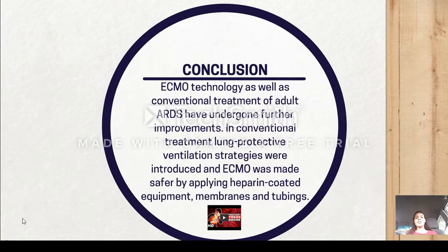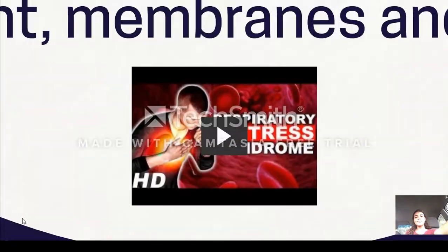Conclusion. Both ECMO technology as well as conventional treatment of adult ARDS have undergone further improvement. In conventional treatment, lung protective ventilation strategies were introduced, and ECMO was made safer by applying heparin-coated equipment, membranes and tubing.